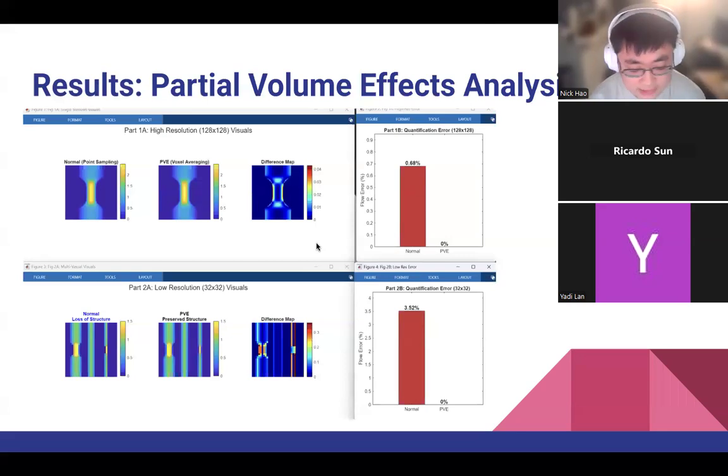In part A, we simulate the single vessel. We define the stenosis geometry because our model follows the conservation of mass. The velocity naturally accelerates as the radius decreases. You can see in the center there's a bright yellow center, and this shows the velocity naturally accelerates as the radius decreases. And here we capture the correct flow accuracy.